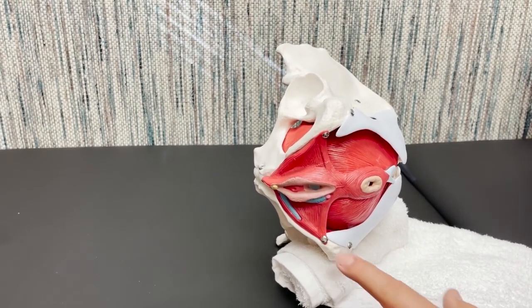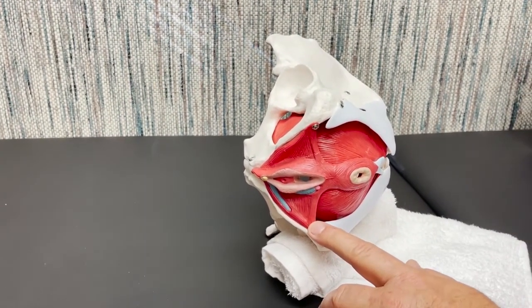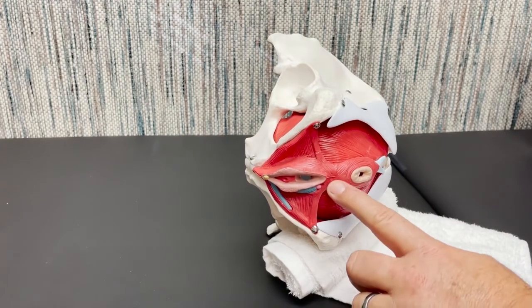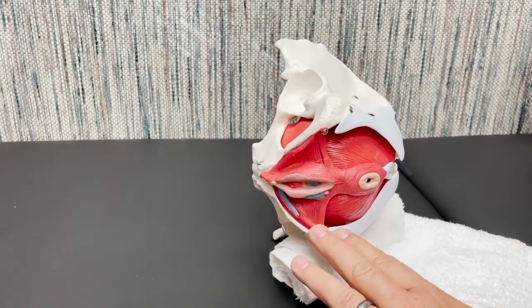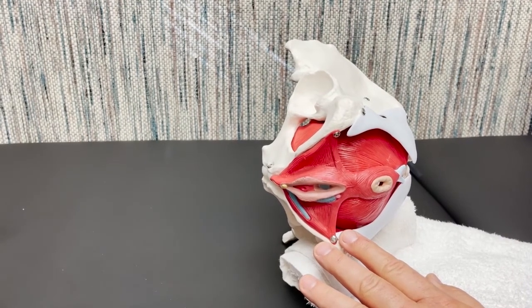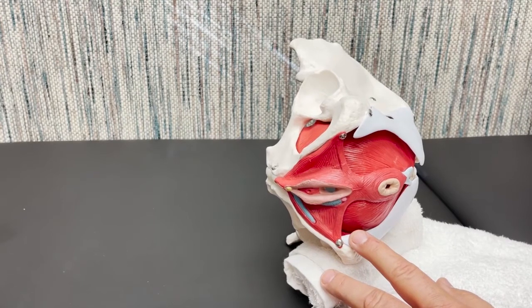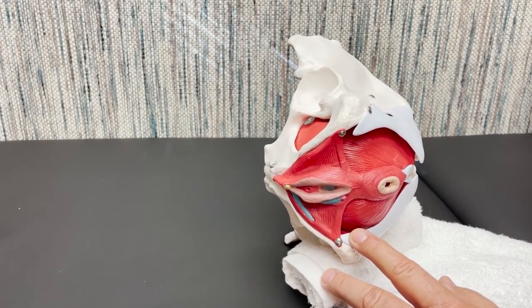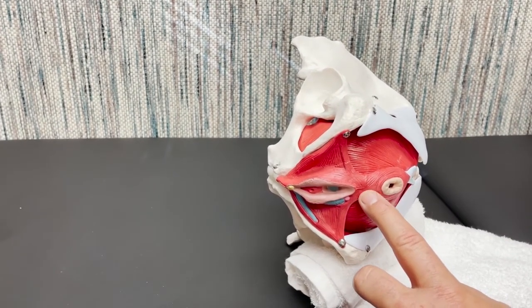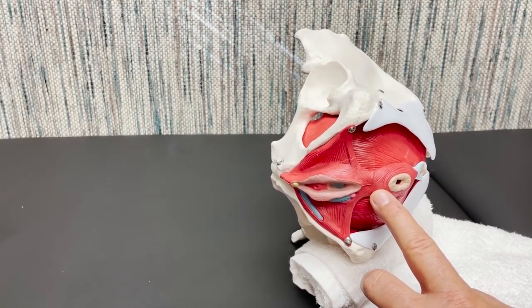We're going to palpate again the medial side of the ischial tuberosity, adjacent to the perineal body. So here, perineal body, we're going to palpate here the ischial tuberosity. We're going to confirm our muscle depth with the pelvic floor muscle contraction again, and then 2 finger breadths lateral from the midpoint between the perineal body and the anal sphincter. 2 finger breadths lateral from there.